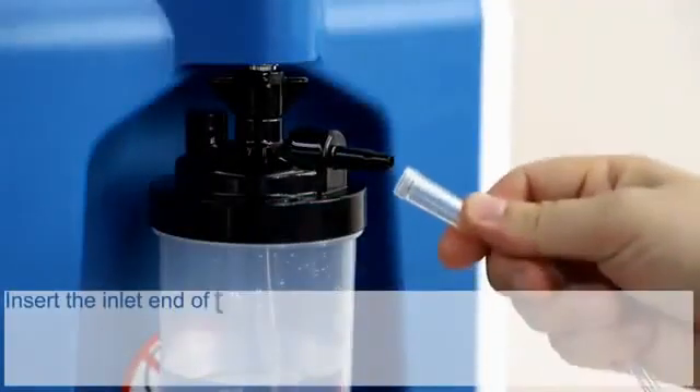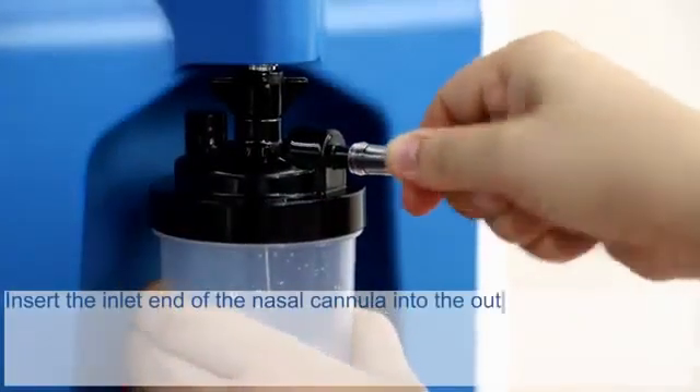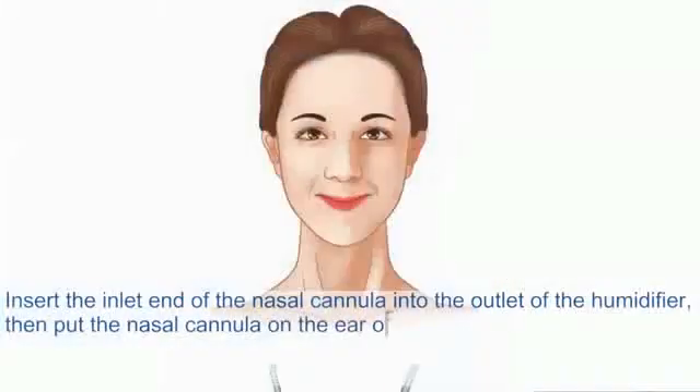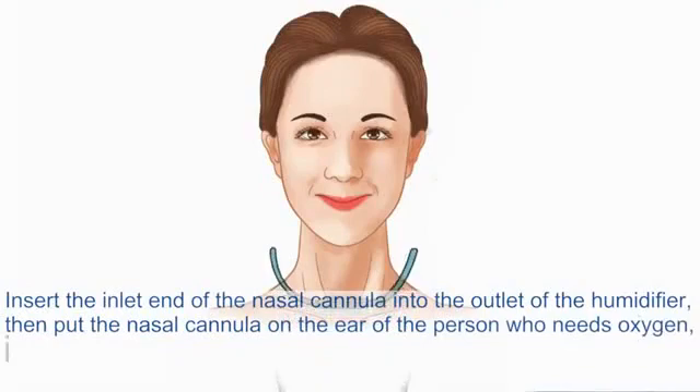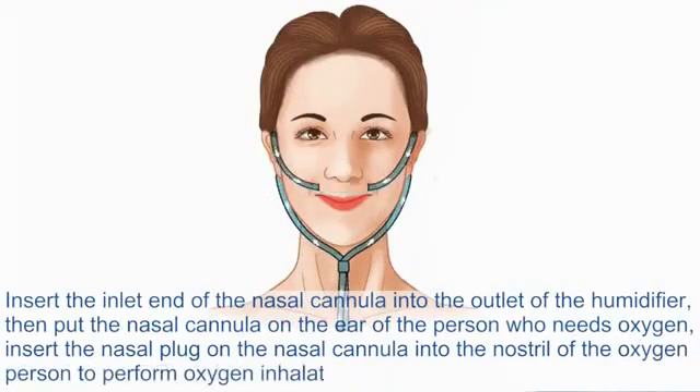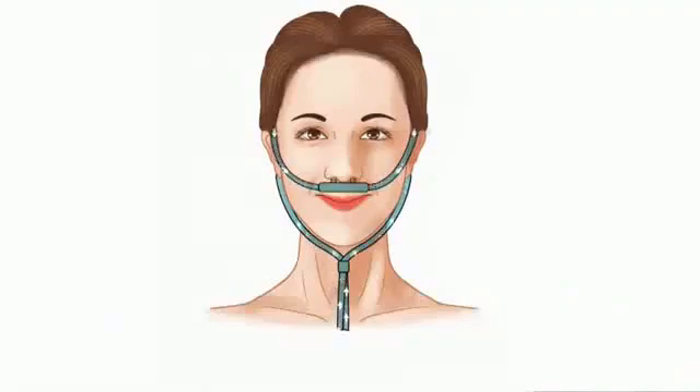Insert the inlet end of the nasal cannula into the outlet of the humidifier. Then put the nasal cannula over the ears of the person who needs oxygen. Insert the nasal plugs on the nasal cannula into the nostrils to begin oxygen inhalation.